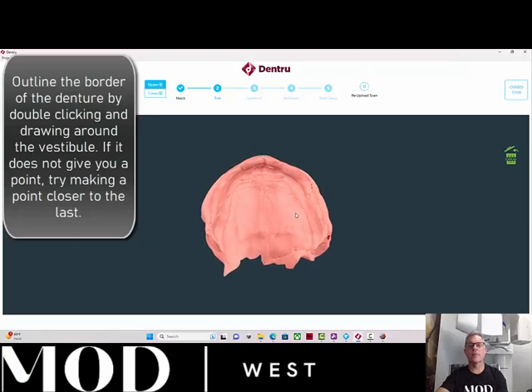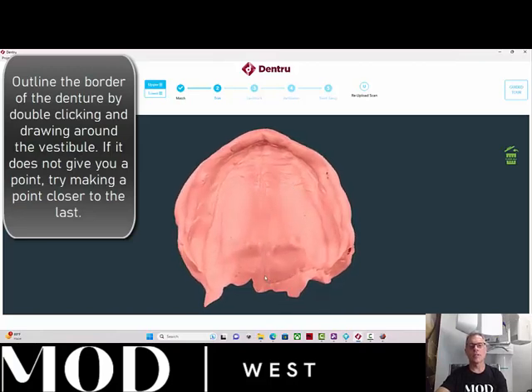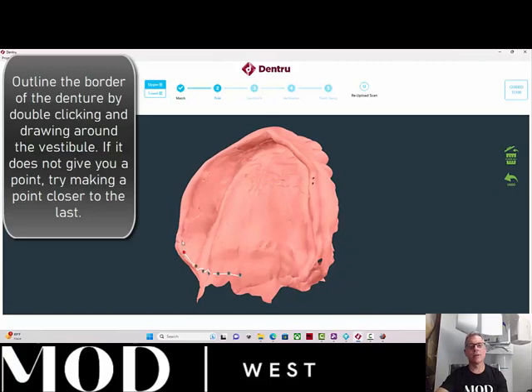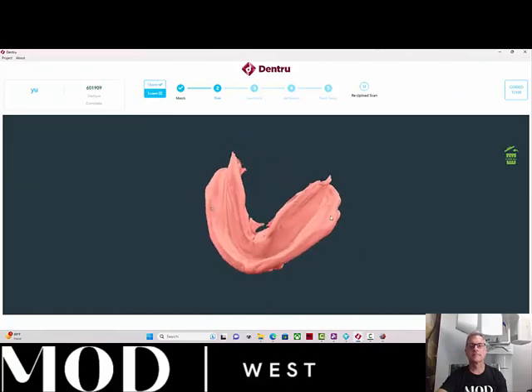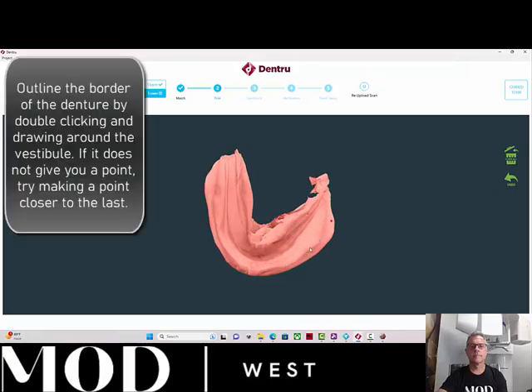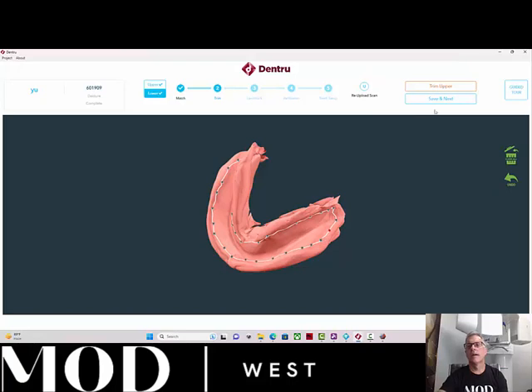Now it's going to ask us to trim — think about the border of your denture in the patient's vestibule and where you want things to be. Start in the post-dam area and double-click to begin. You're just going to double-click points around the border. If it keeps turning off your dots, try getting a little closer to each other. I'm going to be about a millimeter shy of the vestibule and go around. Do the same on the lower — if it doesn't let you, it wants the points a little closer. Then hit Next.